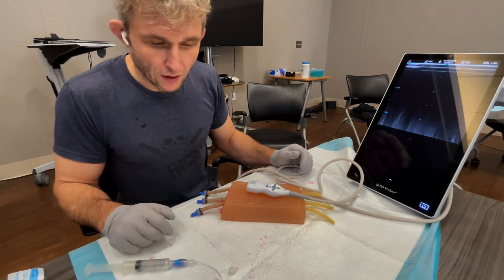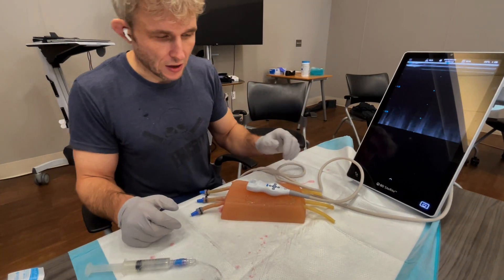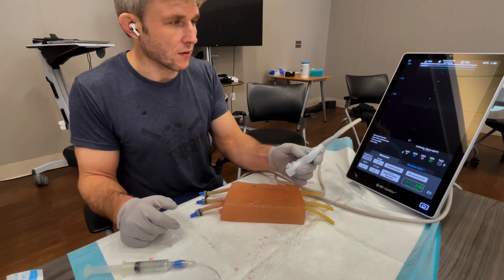We're going to do this with aseptic technique, so you don't have to be sterile, which means you can have an ultrasound coat cover or a Tegaderm on the end of it.